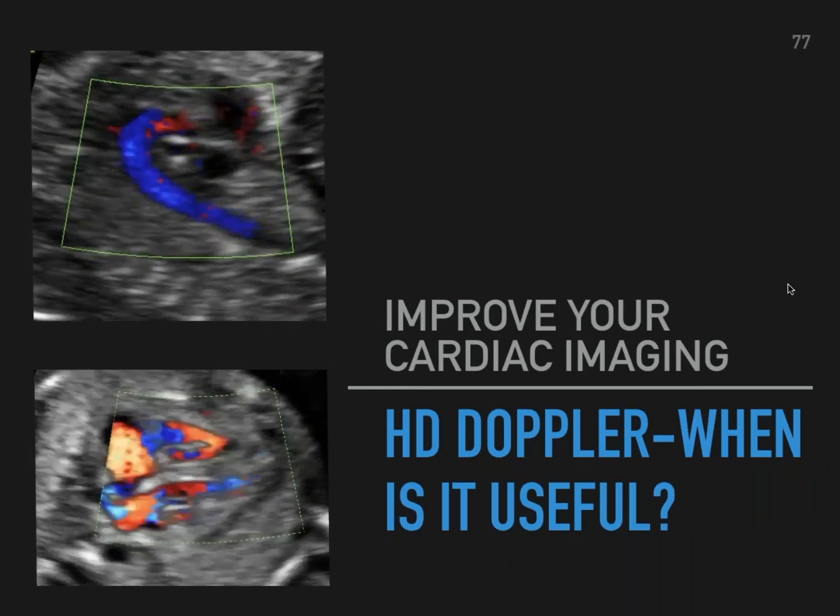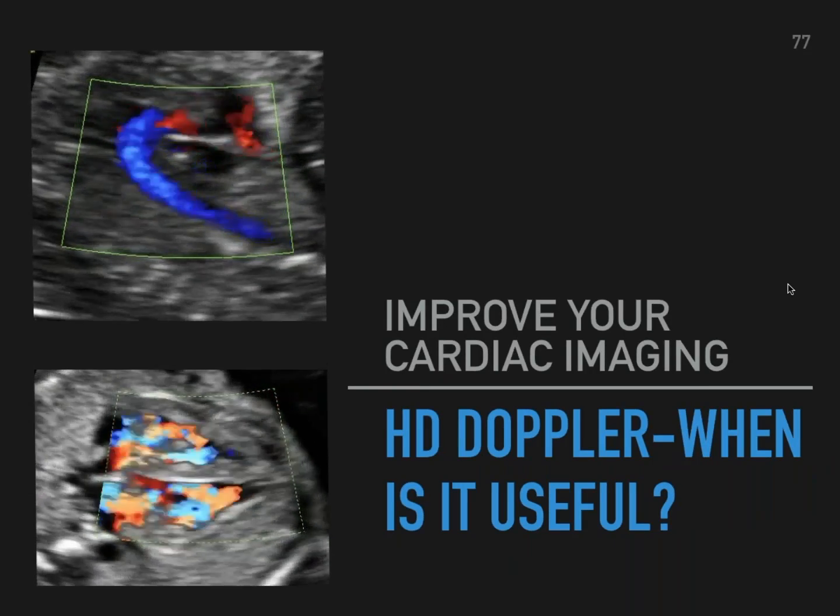Our last section is high definition Doppler. When is it useful?